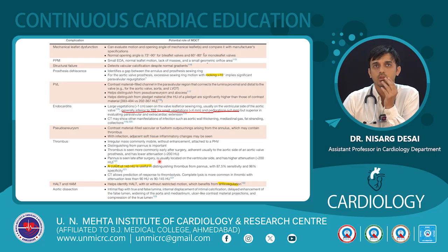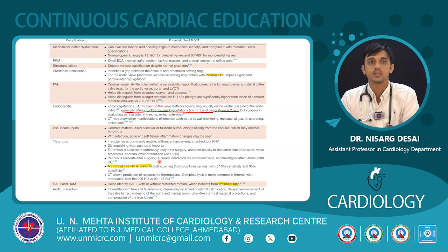Pseudoaneurysm, again, there is a role of MDCT or cardiac CT. Thrombus cutoff, as discussed, was less than 200, but a cutoff of 145 is used for distinguishing thrombus from pannus with 87.5% sensitivity and 96% specificity.